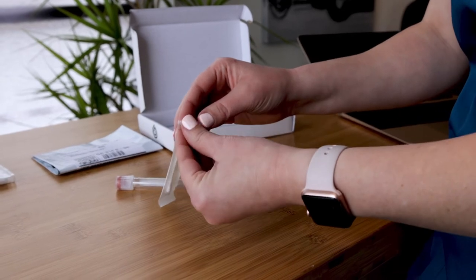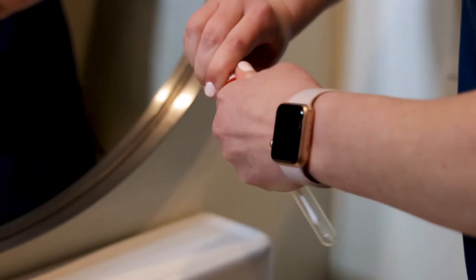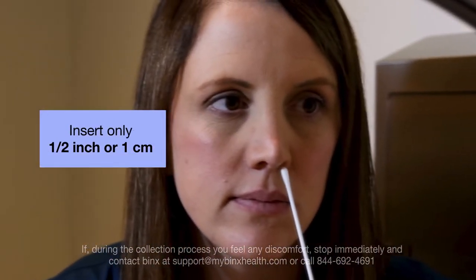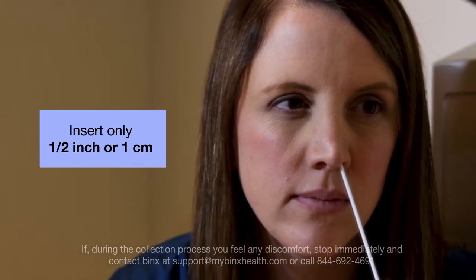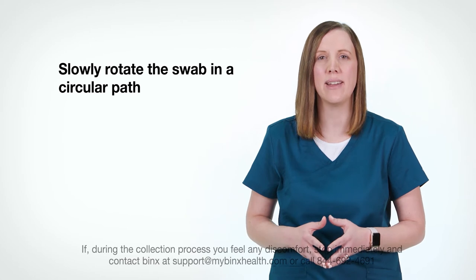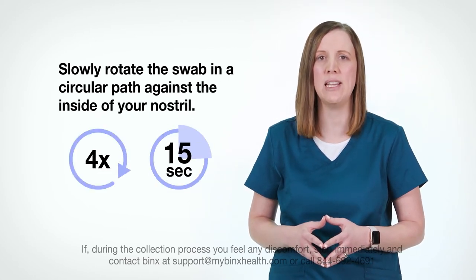If it is a peel pouch, open the package where indicated and leave the swab in the package for now. If your swab comes in a tube, pull up to remove the cap from the collection tube. Carefully insert the swab approximately one half inch, or one centimeter, into one nostril. Do not push the swab into your nose any further. Slowly rotate the swab in a circular path against the inside of your nostril at least four times for a total of 15 seconds.